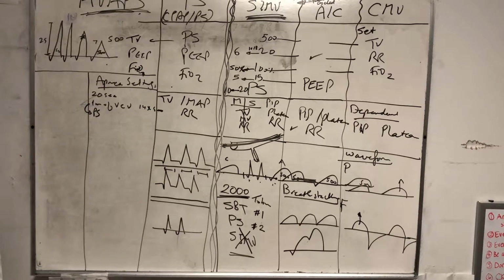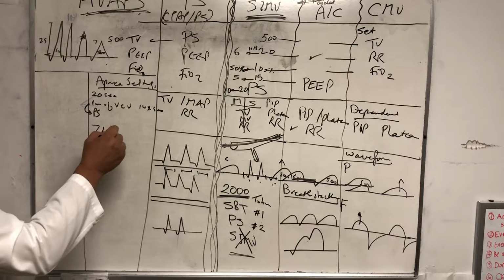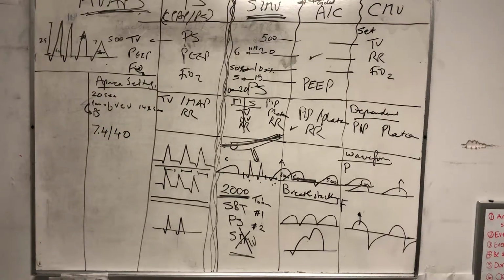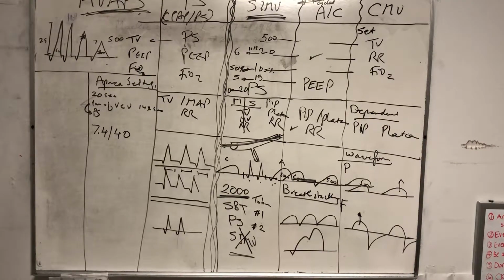That's number one. Number two, the causes of being apneic on SBT: either you're too sedated, or you're over ventilated. Okay, so how does this happen? Basically, you have to think about it in terms of pH. Let's say I walk into this room with a pH of 7.4 and a CO2 of 40, and I'm giving a lecture now. I keep talking, and unconsciously, my respiratory center is going to say, stop talking, take a breath, and continue to talk. I'm not going to even feel it, right?